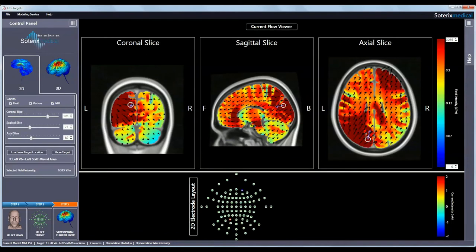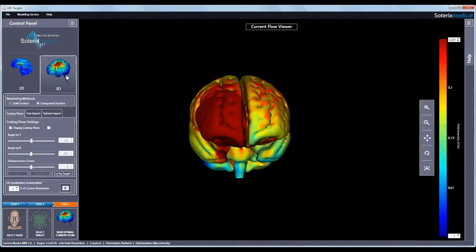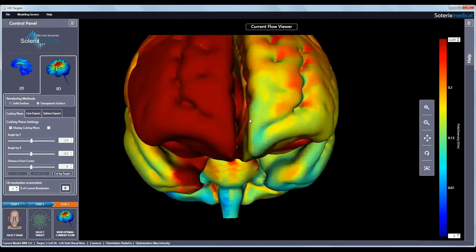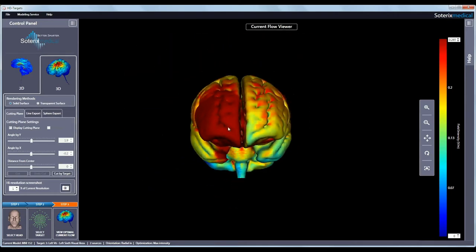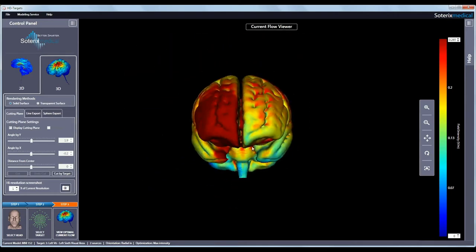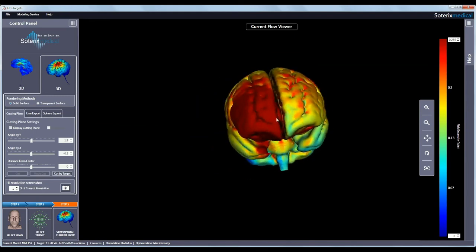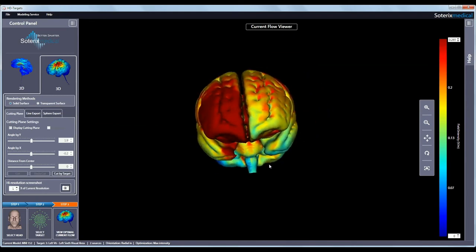To explore the current flow in 3D, just click the 3D option in the control panel. The model can be rendered either as a solid surface or a transparent surface. The solid surface is the default view. You can zoom, change view, move, and rotate the 3D view as before using your mouse and keyboard.